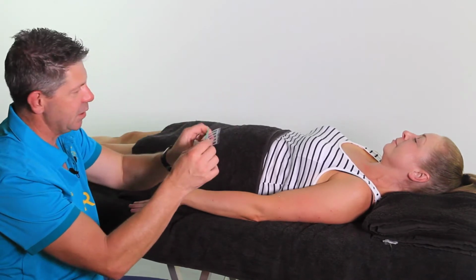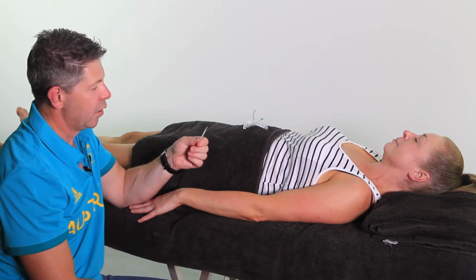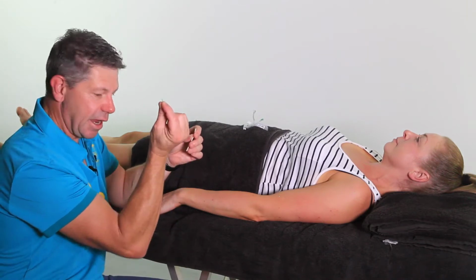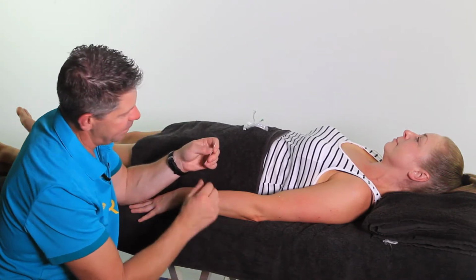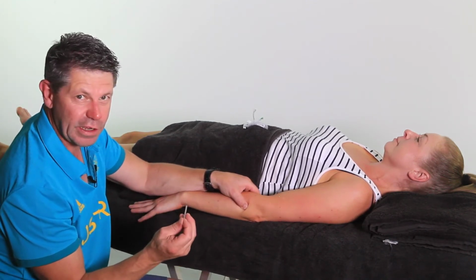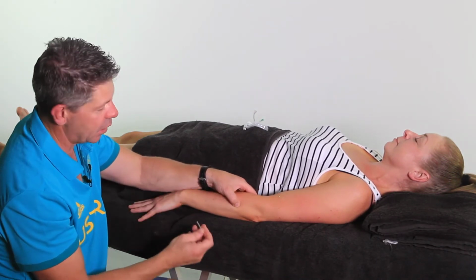Now, the needles we're using, okay, they're tubed, so they've got the guide. I always tend to use these, and they're obviously not reusable, they are disposable. So you'll come with a little tab, put that in the sharps container. Okay, so simply being with really effective dry needling, it's all about finding the trigger points and needling those. It's not just about putting them anywhere, okay?